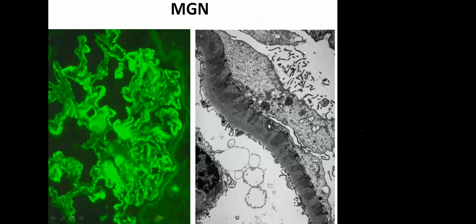So if you find immune complexes on the epithelial side, that means just beneath the podocyte or visceral epithelial cell, these are called subepithelial deposits. Now, if you find deposits towards the endothelial side, which are not seen in this case, then they are called subendothelial deposits. So in this case, there is membranous pattern and there are diffuse subepithelial deposits.